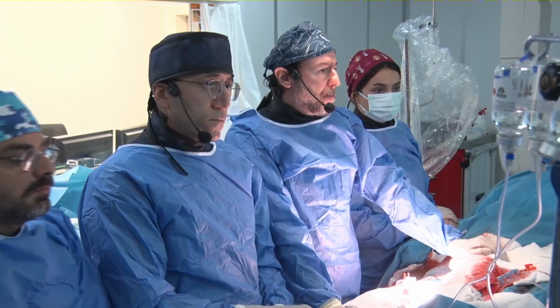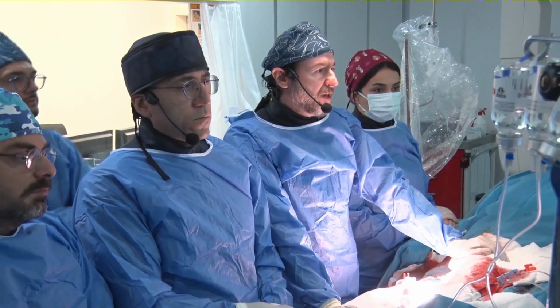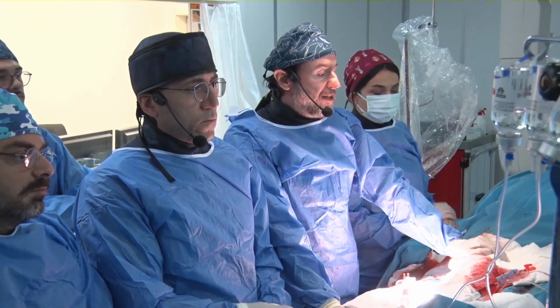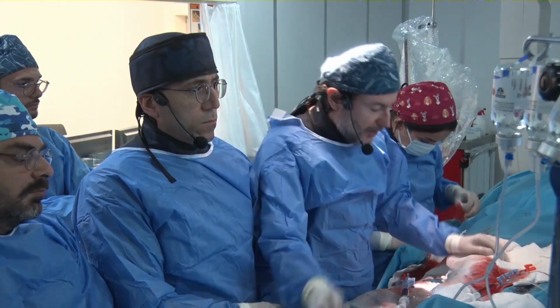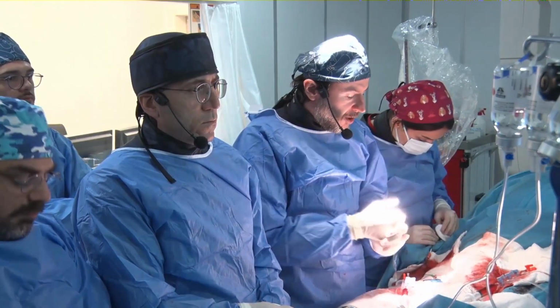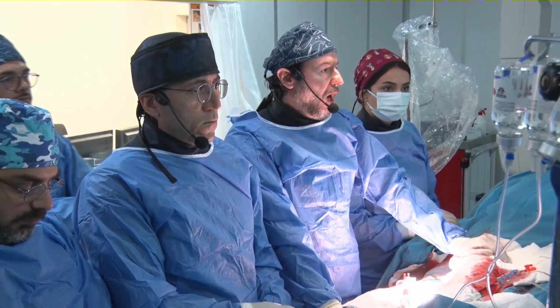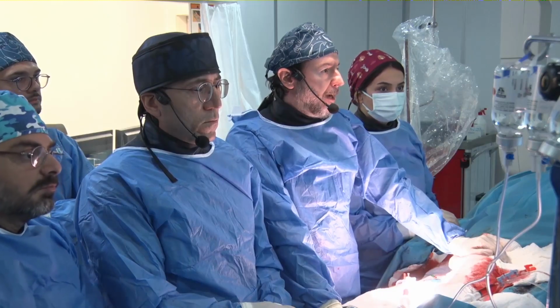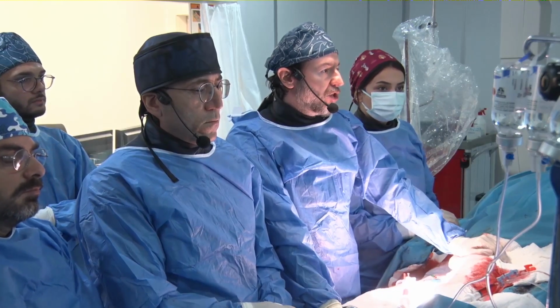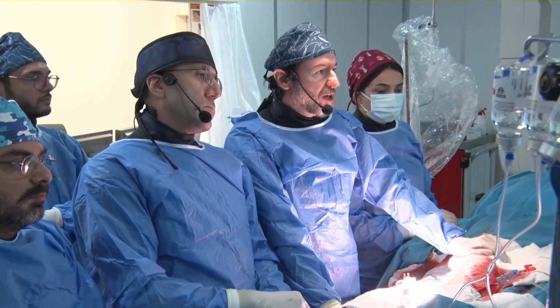Our beginning was therefore retro because this was the only option here. We didn't take too many views of the patient because the ejection fraction is 30, and the patient has a previous heart failure history and renal failure problems. With this low ejection fraction, I don't have many options here. So that's a little bit distressing and annoying.